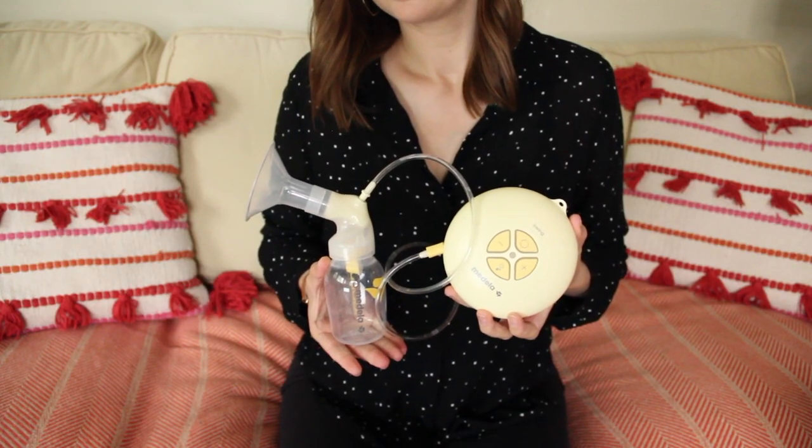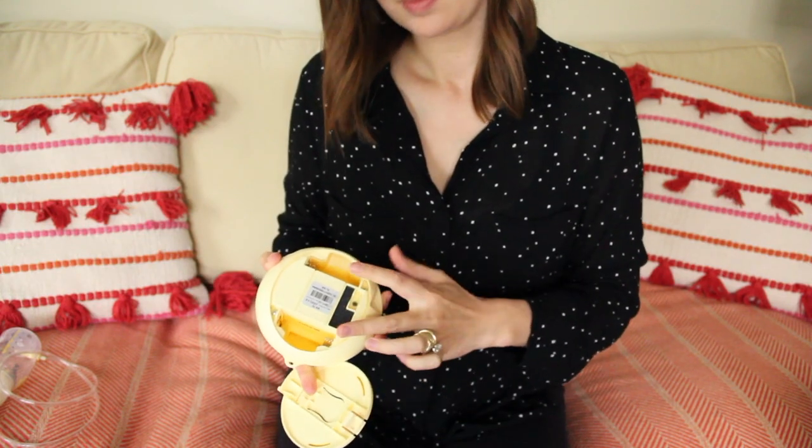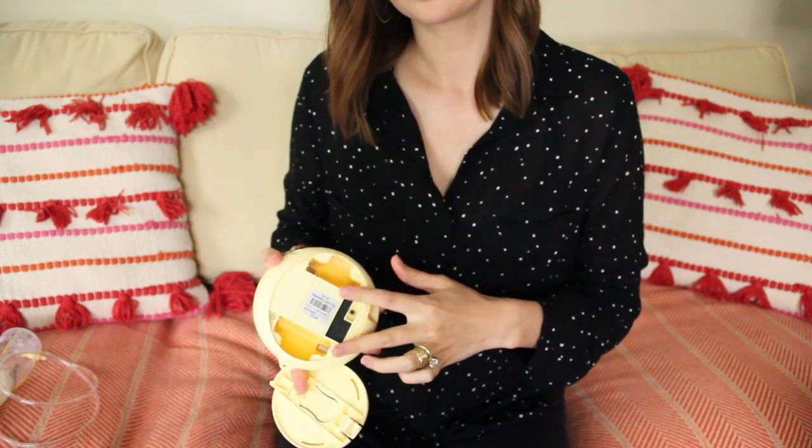The Medela Swing is a single electric breast pump. It's best for occasional use, it's nice and compact, and it can run on AA batteries so you won't have to be stuck next to the wall outlet. A lot of moms actually like to keep this one at work.